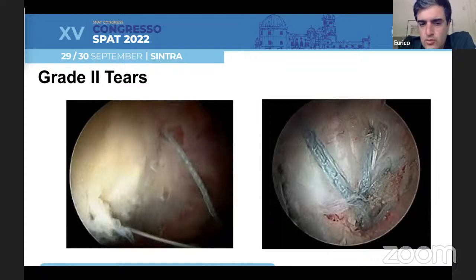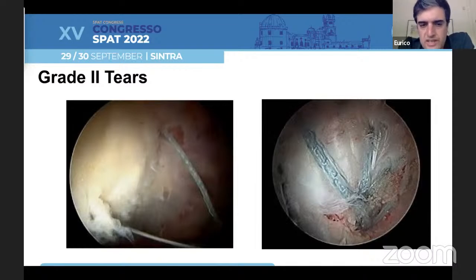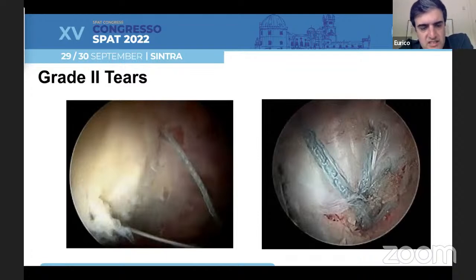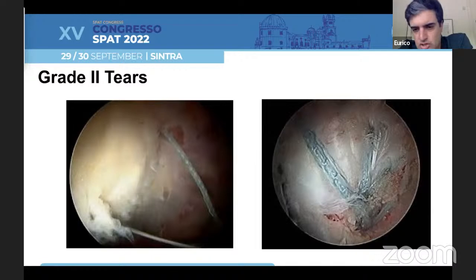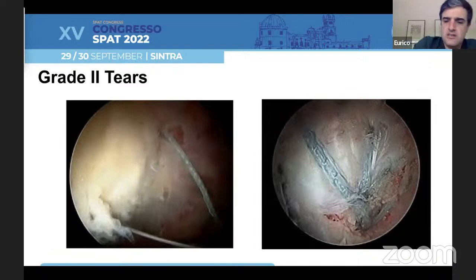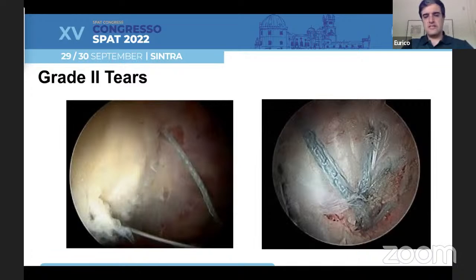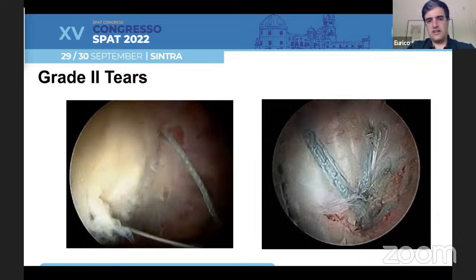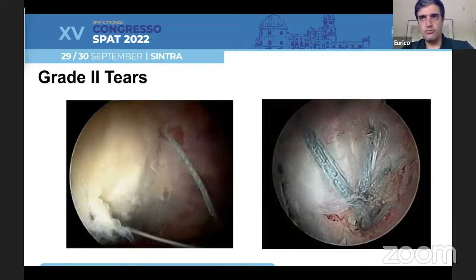In grade two tears, when we have less than 25% of the tear, we can do a transtendinous technique. There's a nice paper published by Benjamin Dome in Arthroscopy describing that. We place our anchors through the tendon and I use this hybrid technique where we use two proximal anchors and one knotless anchor placed distally on the construction. I think this gives an excellent compromise between maximizing tendon-to-bone contact without compromising much of the tendon vascularity.